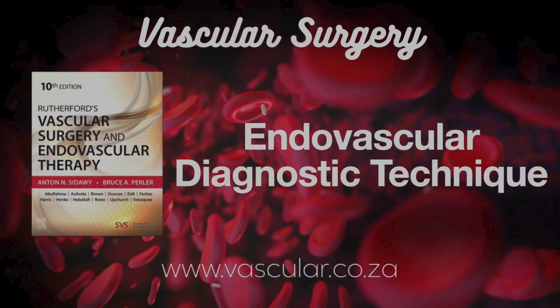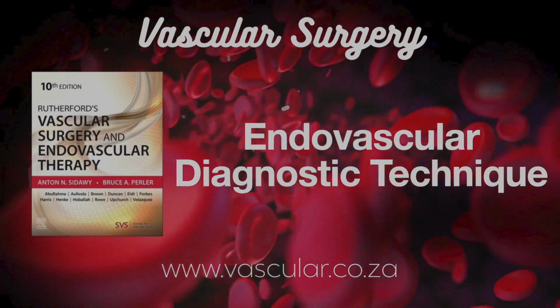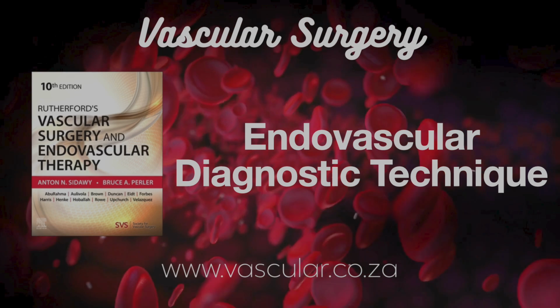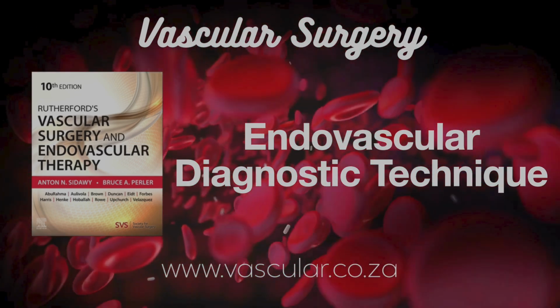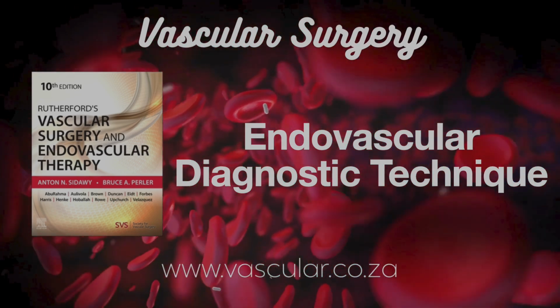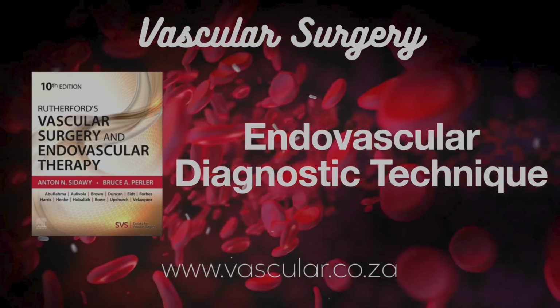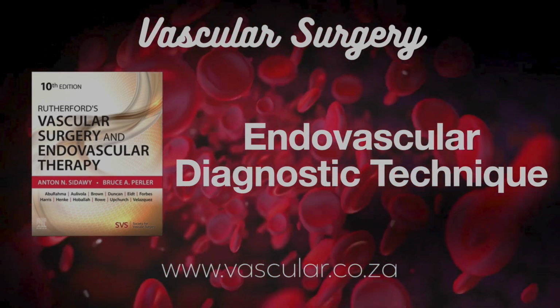They have a one-way valve at the hub to stop blood coming back out, a side port for flushing, injecting contrast, or drawing blood. They come in different lengths and diameters, measured in French size. 1 French is 0.33 millimeters. What are common sizes? For diagnostics, maybe 4 to 7 French usually, up to 11 French, or even much larger for big devices like aortic endografts.